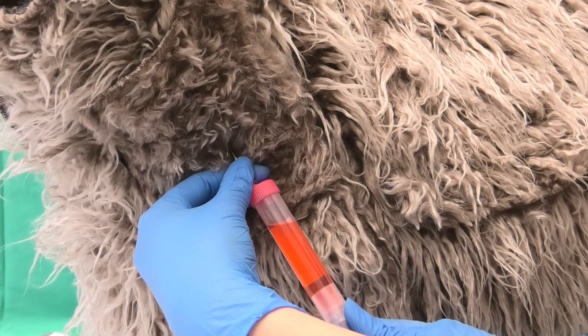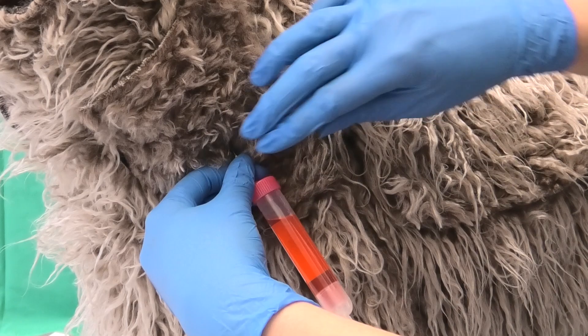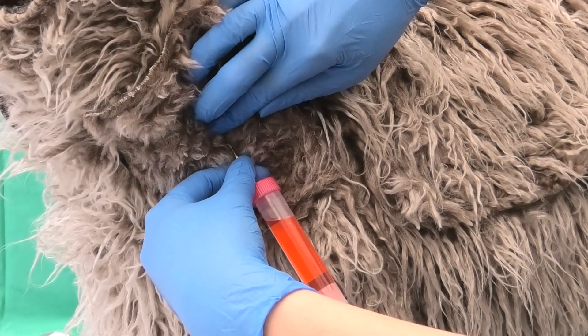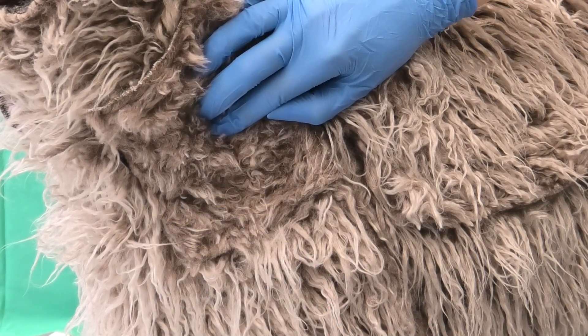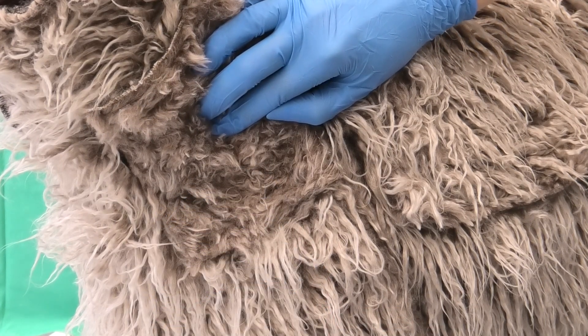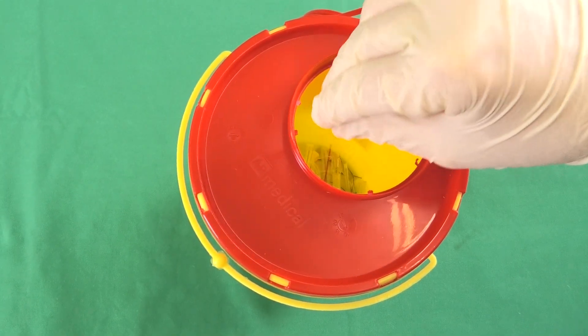After enough blood has been taken, the vein is compressed cranial to the puncture spot. It is important not to compress too close to the puncture spot, so as to prevent the cannula tip from damaging the other vein wall. The cannula is removed and the area above the puncture spot is compressed for a few more moments. The cannula is then disposed of into the designated container.